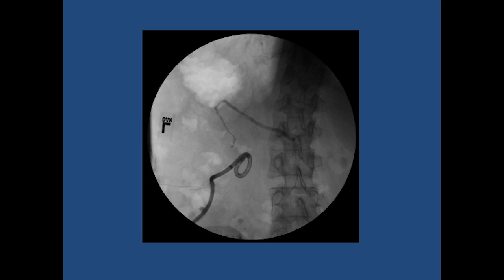Pancreatic leaks are notorious for being persistent and recurring when drains are removed. So in this particular case, when there is a persistent communication with the pancreatic duct, it's important to really be sure that the patient's output from the drain is minimal to none. Any substantial output of pancreatic fluid or pancreatic juices through the drain itself should make the operator wary of removing the drain too early.